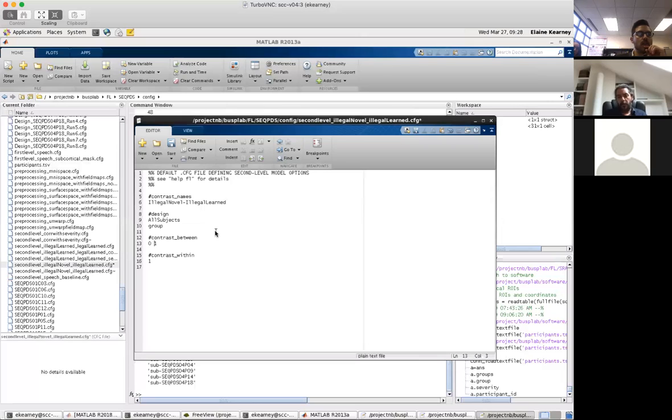Well, you would typically do it just to see where you're going to get a positive number where the activation is greater in the second group compared to the first, but you're not going to know whether the activation was actually positive activation or negative inhibition, like a negative activation. So it's always a good idea, in any regions that may come up in this particular analysis, to do post-hoc analysis looking at the actual activation within the two groups, and make sure that you're interpreting those correctly. Okay, that makes sense.